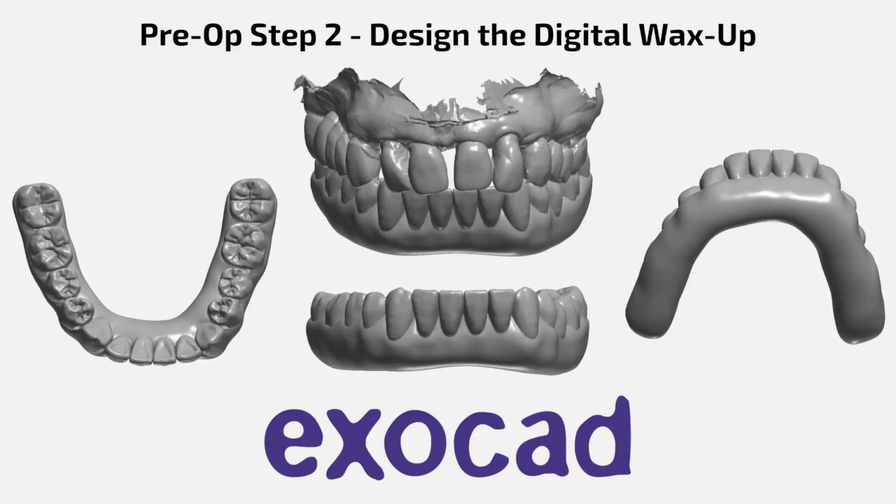So this is that digital design. For this patient, we did the facial records, we did the bite records, and the lab was able to make this really nice design for the lower prosthesis that we were going to be using on the patient that day in surgery. And this is basically the purpose of those initial scans. What you'll eventually get here is a prosthesis that's lined up in three-dimensional space to the bite record.